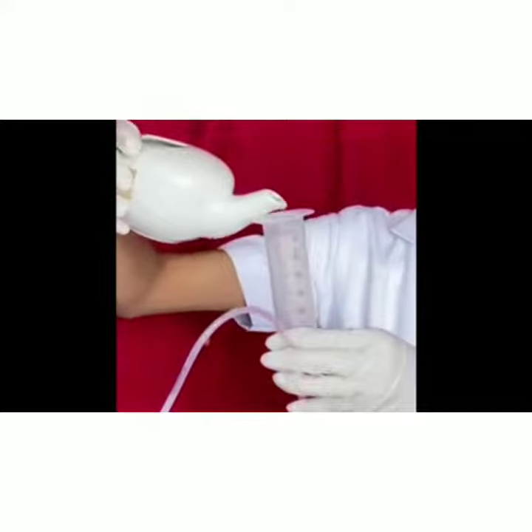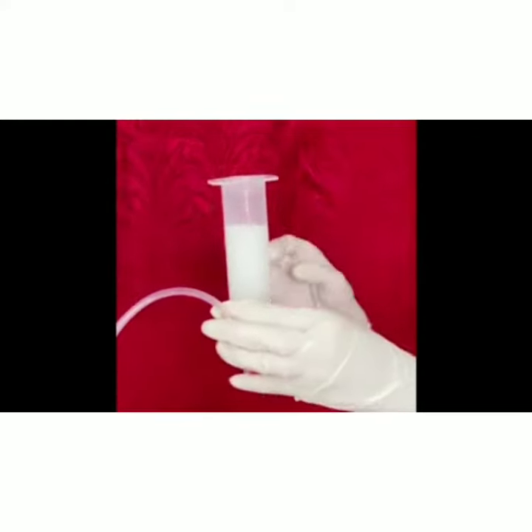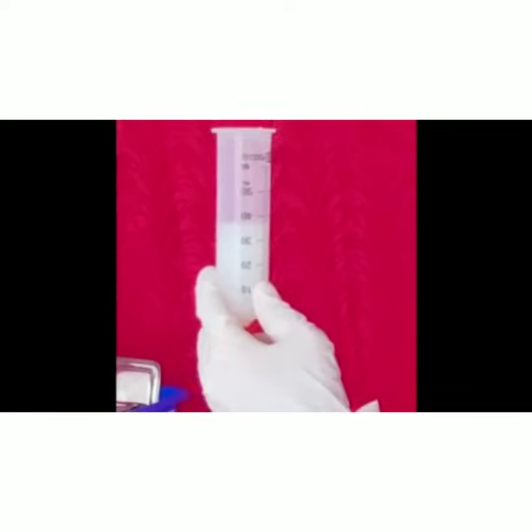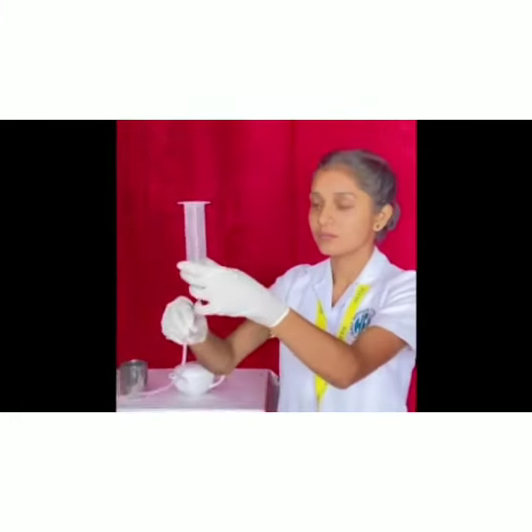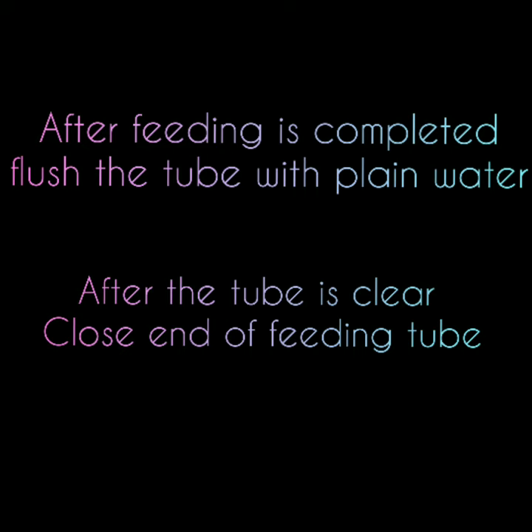Pour feed into the syringe barrel and allow it to flow by gravity. Flush the tube with plain water. After the tube is clear, close the end of the feeding tube.